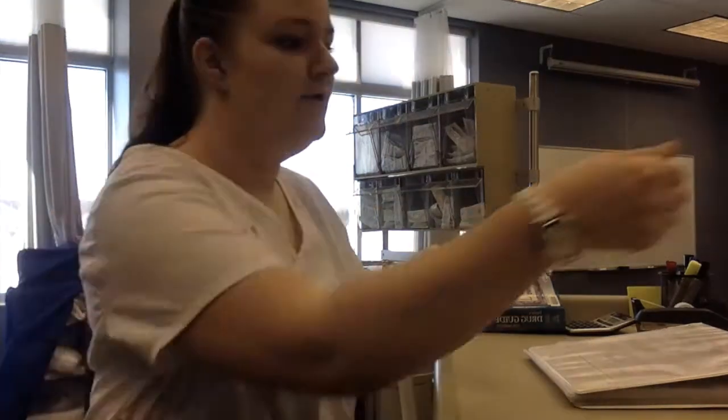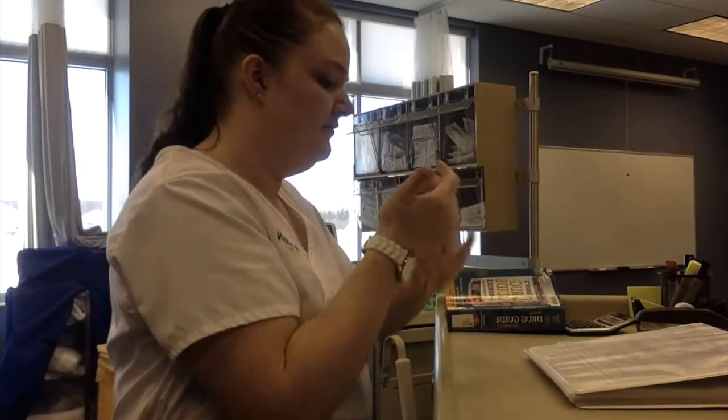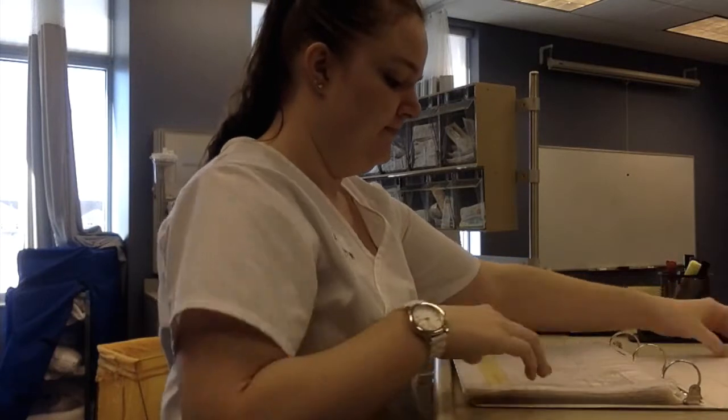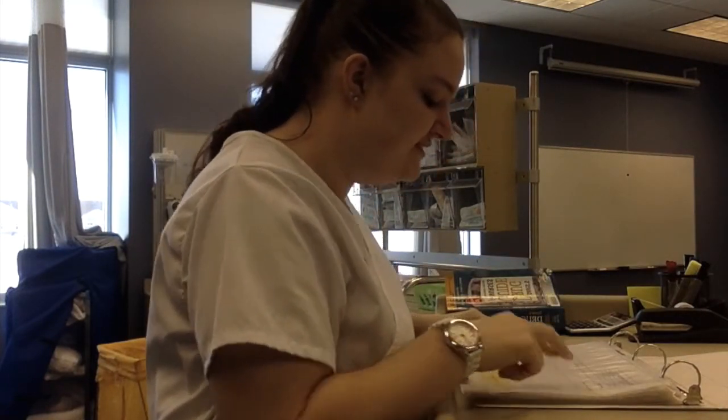Hello, this is my IM injection video. To begin, I will wash my hands. I will then open my MAR and be giving naloxone 400 mcgs IM stat.